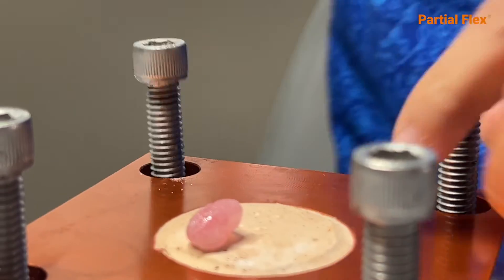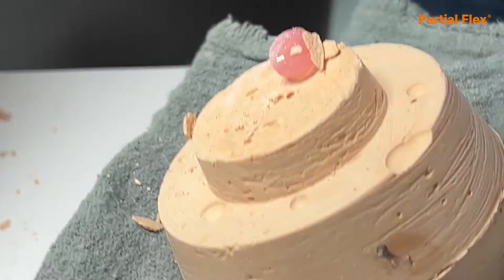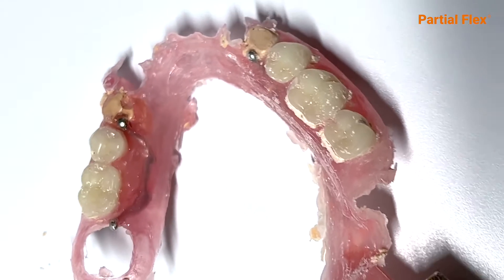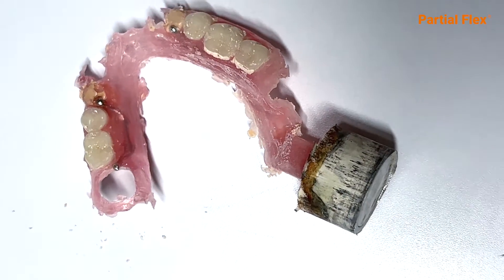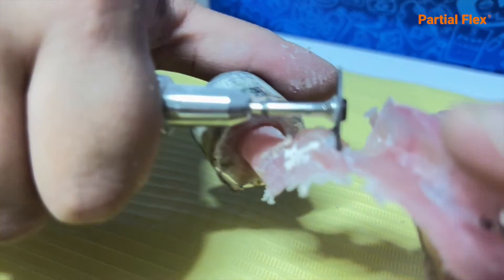After 25 minutes, open your flask by tapping the plaster firmly with a hammer. Recover your case. With just one sprue, the injection is recovered. Cut the sprue with a flexible diamond disc.